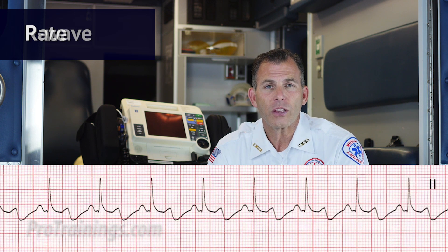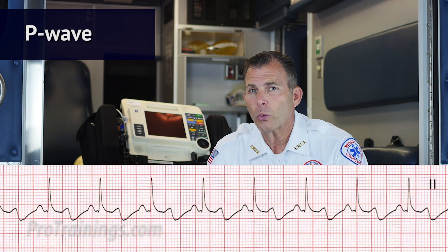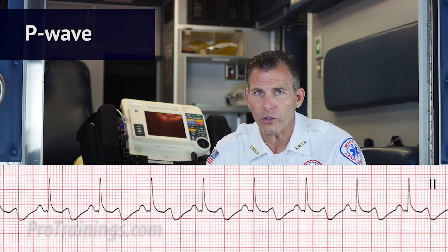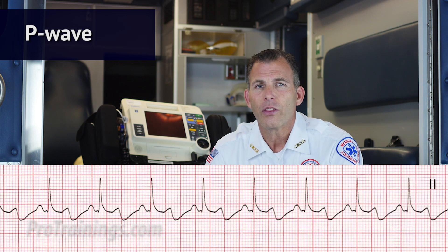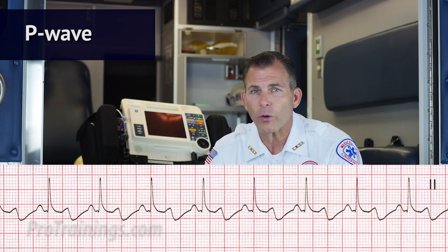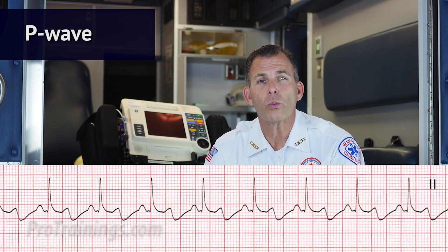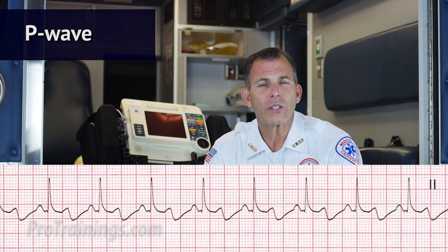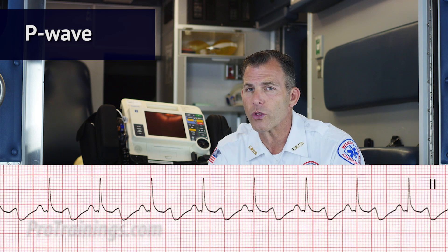Next we evaluate the P wave. Are they present? We can clearly see that the P waves are indeed present. Do they occur regularly? Yes, each of the P waves does occur regularly. Is there one P wave for each QRS complex? There is one P wave for each QRS complex. Are the P waves smooth, rounded, and upright? Yes. Do all P waves have similar shapes? Each has a uniform shape and is smooth and rounded.